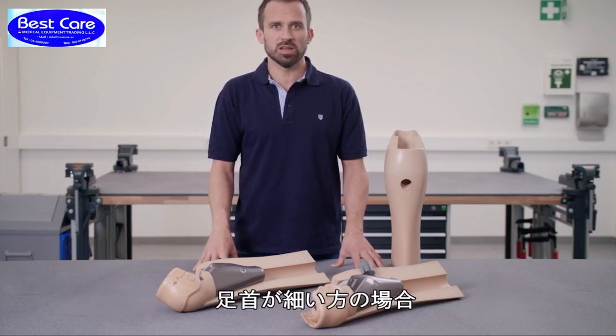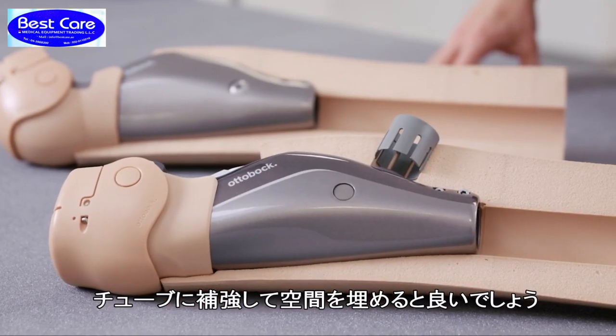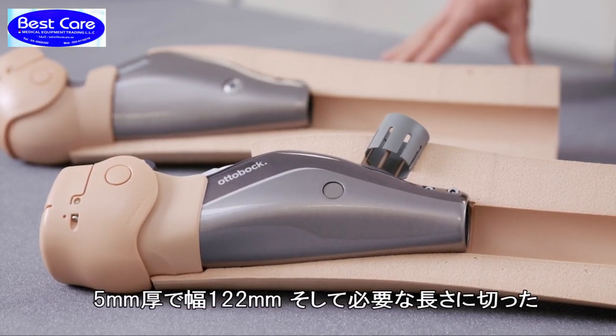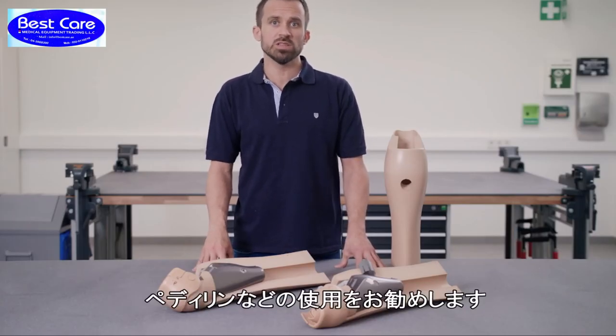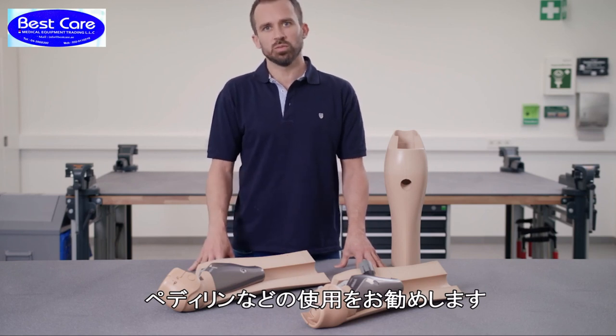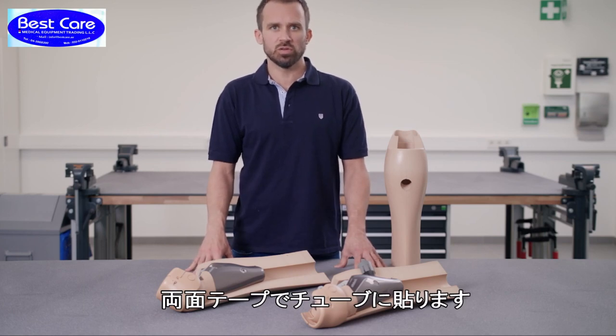For smaller ankle sizes it may be necessary to make the diameter of the tube a bit larger. My recommendation: cut a piece of Pedalan or Plastazote to a thickness of 5 mm, a width of 122 mm, and the same length as the tube. Use double-sided adhesive tape to affix it to the tube.